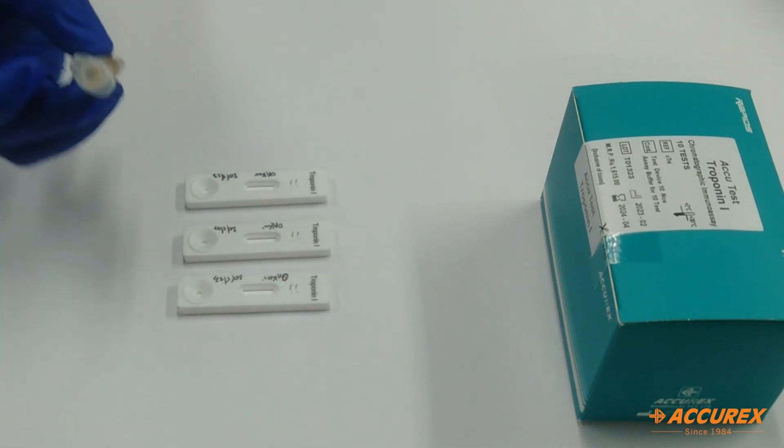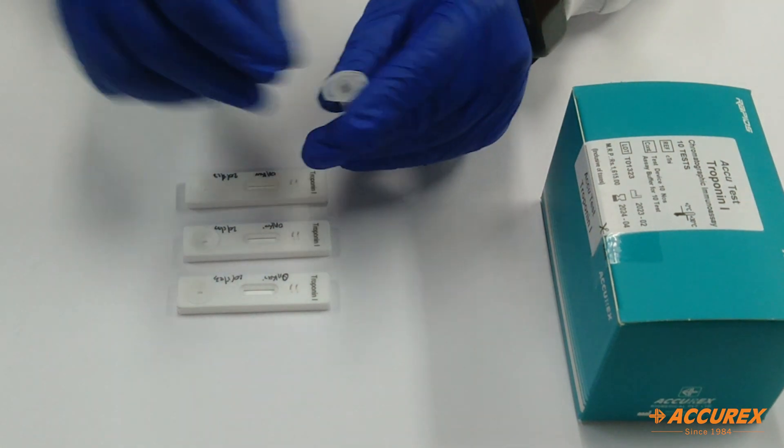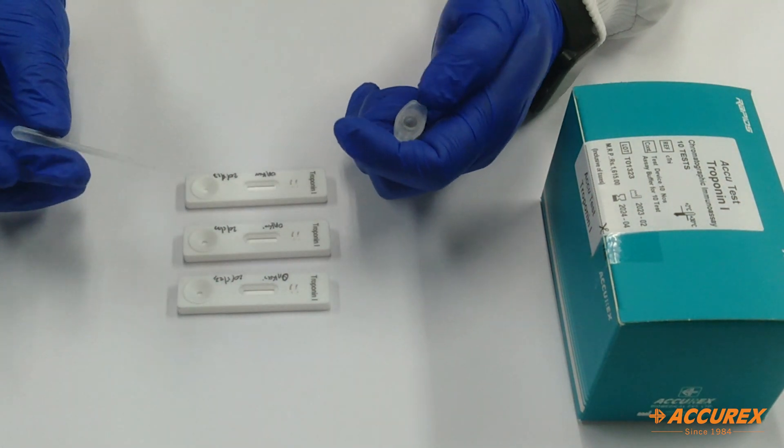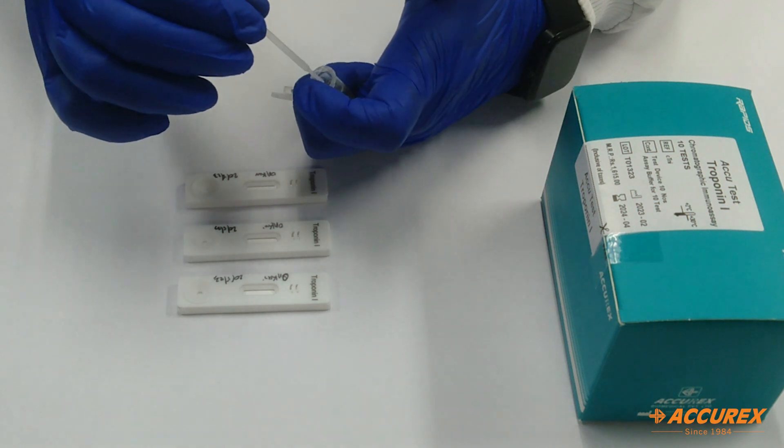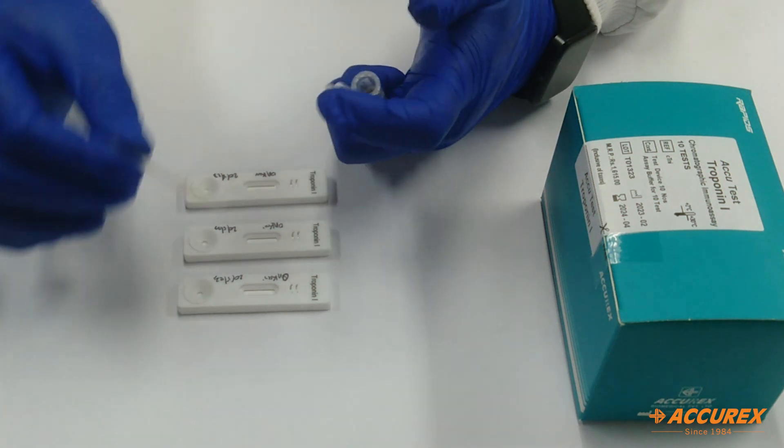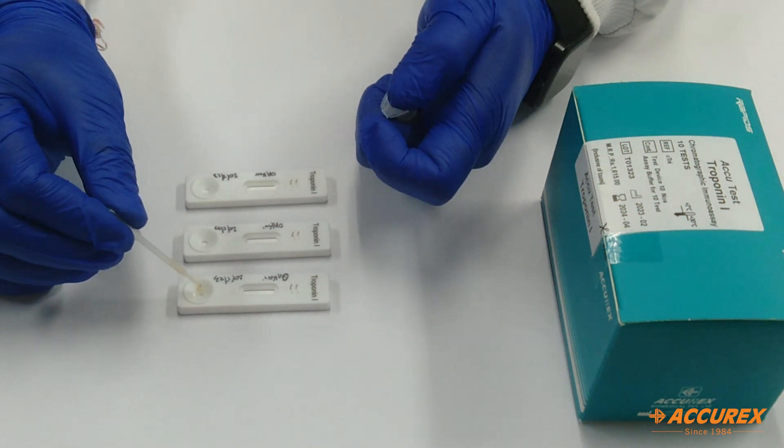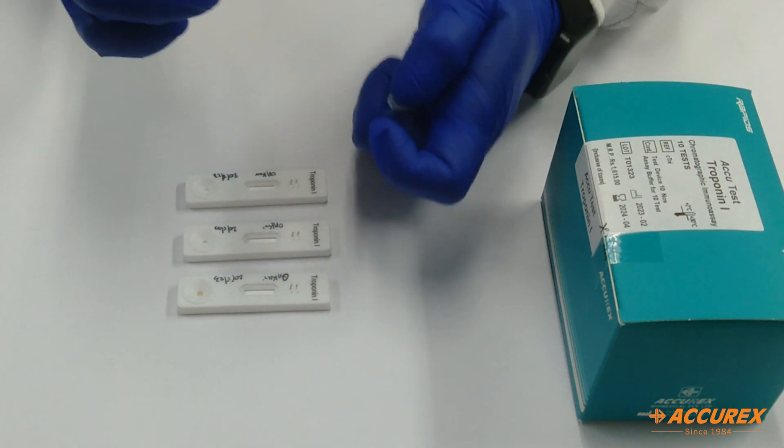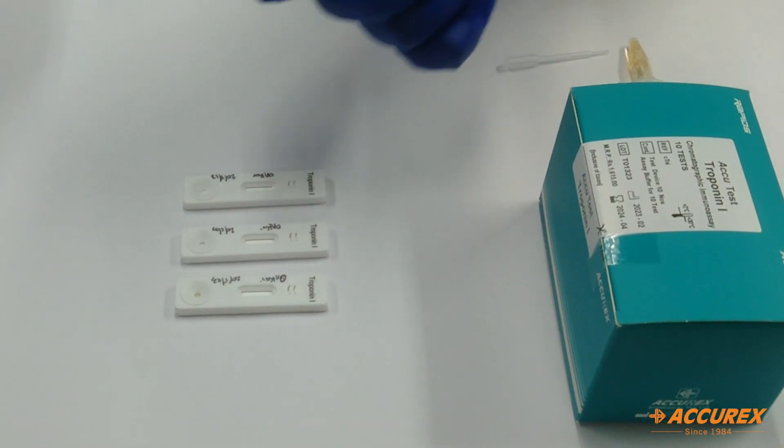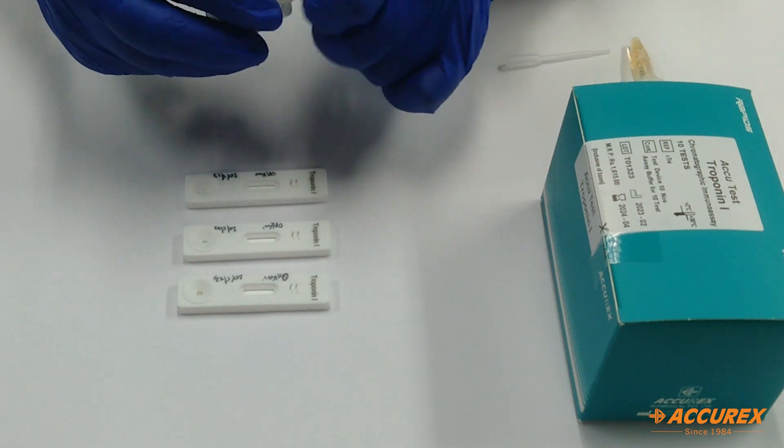For the serum sample, I have taken this. Here you need to add one drop of serum, followed by one drop of buffer.